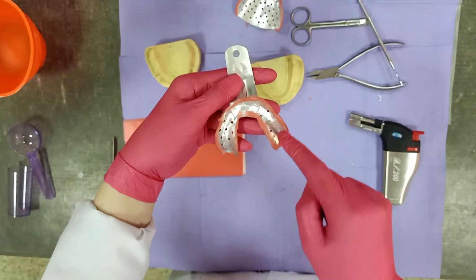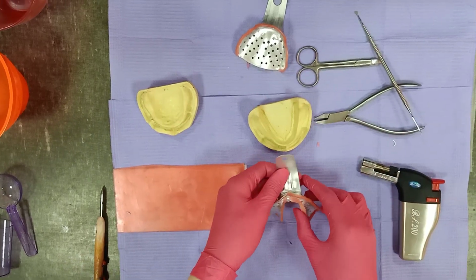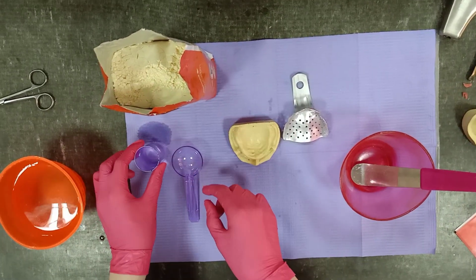Also, as in the upper, be sure that all your borders are smooth. Now for taking the impression.